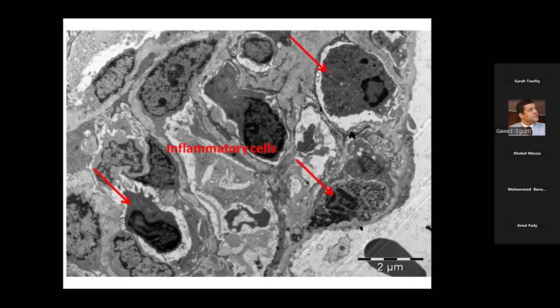You said that the cell on the top right is a neutrophil? No, I don't say that. It's mostly a neutrophil, but the segmented nucleus is not here in this cut. But that's the segmented nucleus. This is a neutrophil. This is its lysosome. That's its nucleus.